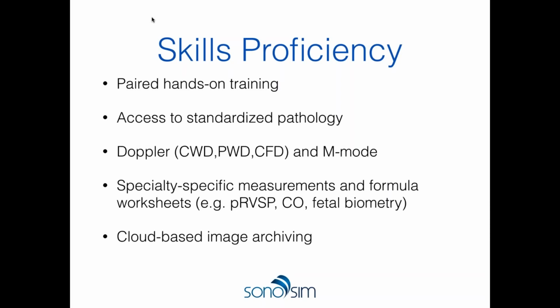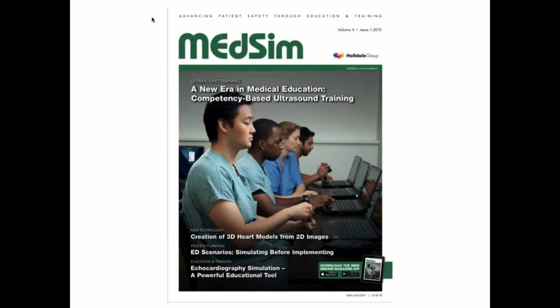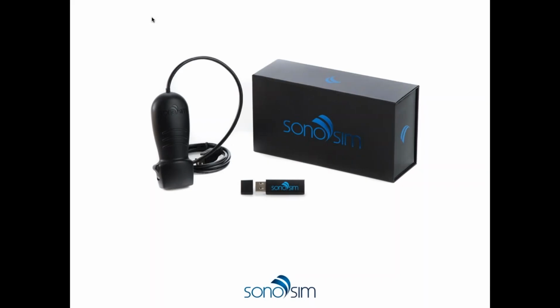Again, you have the user go through a didactic session. That was tracked in the cloud. You had them complete a hands-on training session with archiving of their images. The way this can be accessed is in a couple of ways. One is through a sim center solution where users would come to the simulation center and perform hands-on training in groups. Again, still in a self-directed fashion. You don't need to have a simulation technologist over them.